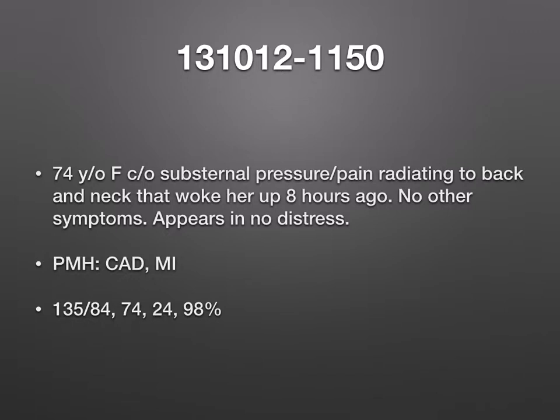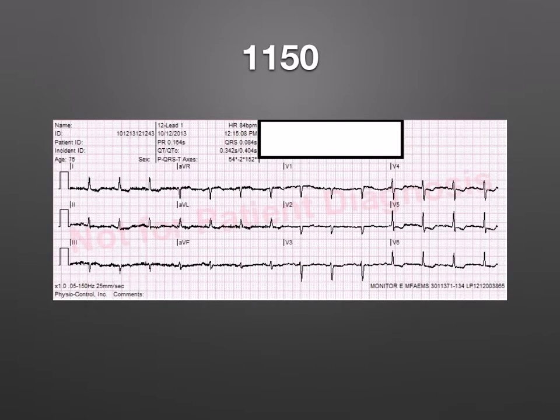And again, a STEMI doesn't have to look like they're in distress, but if they look happy and they're munching on their Cheetos, it doesn't rule it out, but it does make it less likely. Again, one more thing to put into the clinical picture. So, decent story in this case. We're a little concerned about the length of time and the no distress part, but let's take a look at the EKG. Now, here's what we see.